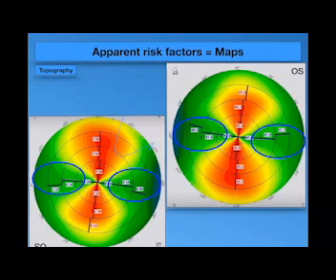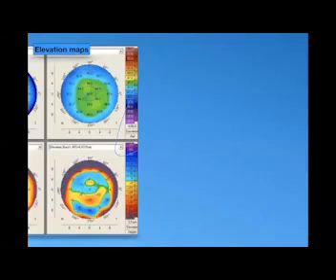So as I said before, the thinning of the superior cornea with protrusion means ectasia and not keratoconus. But you have to see on the slit lamp the real thinning, not just scarring or pannus. If there is a normal thickness at this point, and there is a steepening higher than 49, even 50, I will go for refractive surgery without any worry. Let's go to the elevation map.